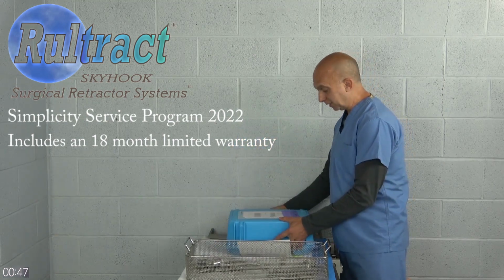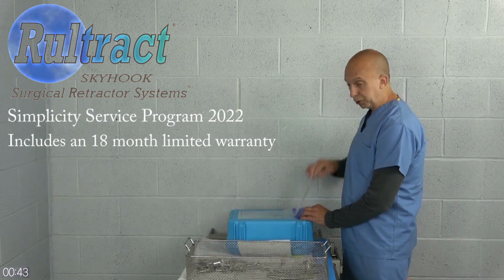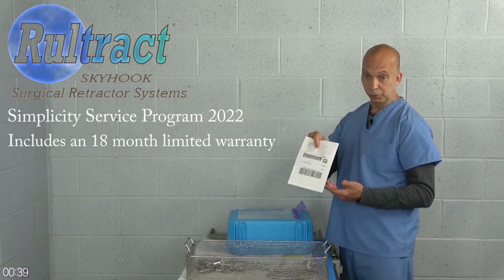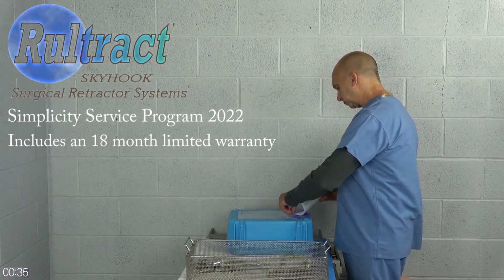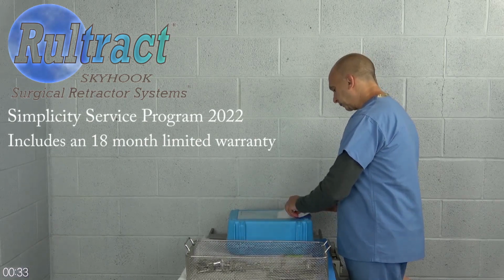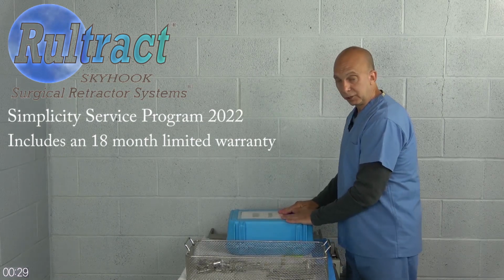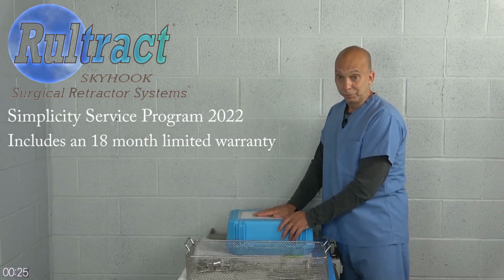On the bottom of the case, you'll find the FedEx envelope. Remove the label that was used to ship the equipment to you. Insert the label that is going to be used to ship the equipment back to us. Be sure that that envelope is sealed securely. Otherwise, that label is going to fall out.